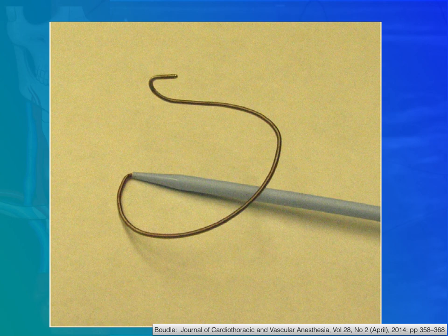Sometimes the wire will not come back from a needle or a dilator. This can be secondary to kinking and happens sometimes. An experienced operator will withdraw all the wire, the dilator, the catheter or needle, and everything together to avoid leaving a piece of the wire inside the vessel. So be mindful of that. If your wire is not coming out, if you have problems taking the wire out, take everything out with you, and you will most likely overcome this type of problem.